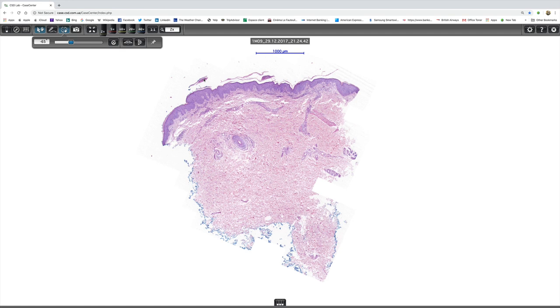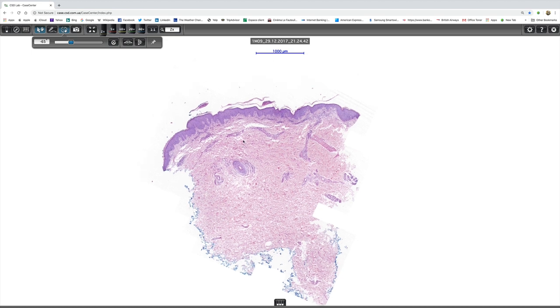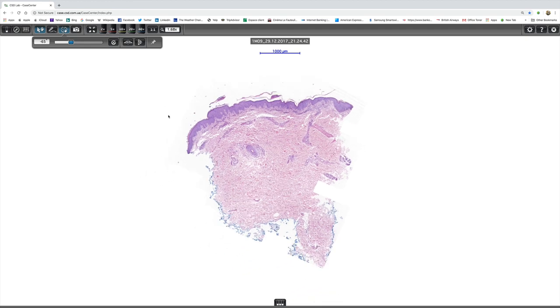Sometimes called Langer's lines. And this gives rise to a fir tree-like distribution of lesions. So, of course, that's quite unlike psoriasis. And the other thing is in pityriasis rosea, you do not see neutrophils. And generally, you'll see foci of spongiosis deep to the parakeratotic scale. And so I don't think in this case we need to think about that at all. But it is a differential that you might think about at low power.